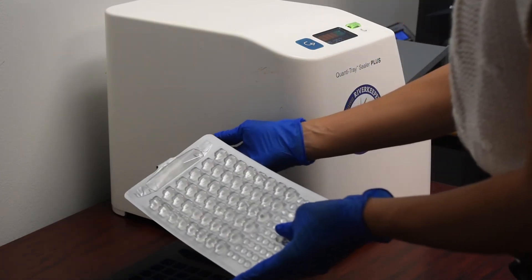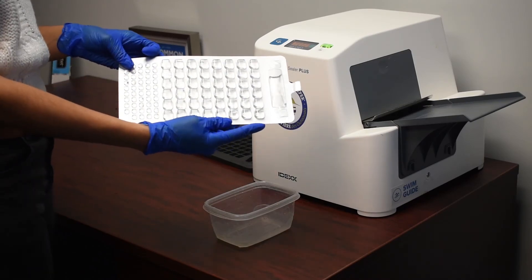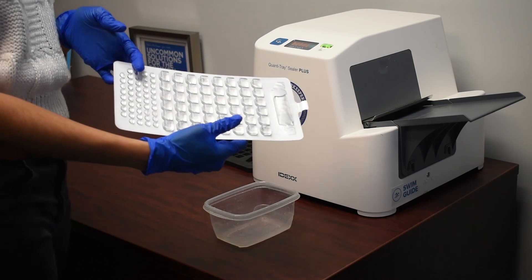After the tray has made its way through the sealer, it looks like this and can be put into the incubator for 18 to 24 hours. Following that period, we will be able to read the samples and have the results for the E. coli.